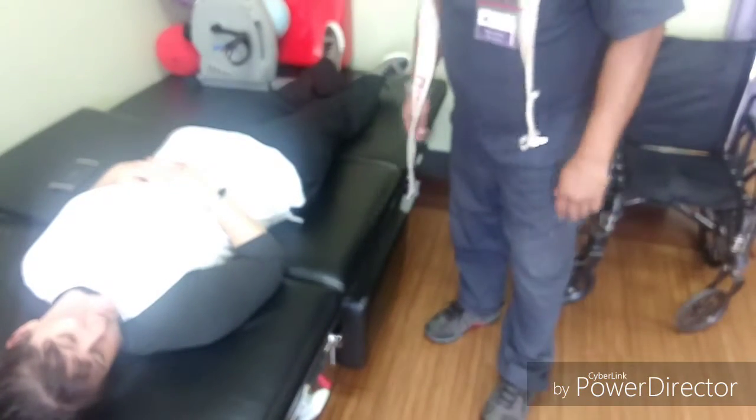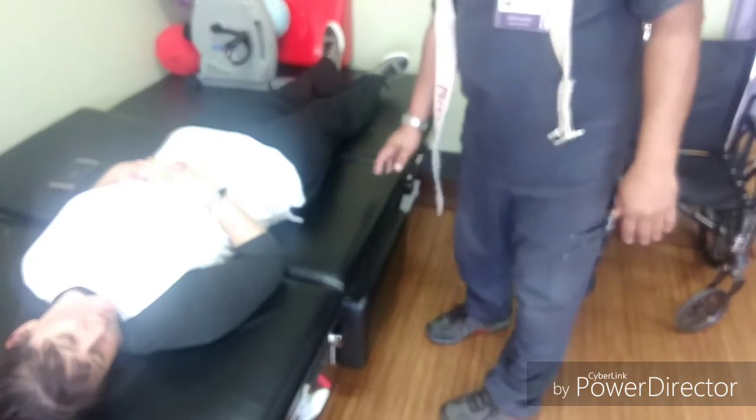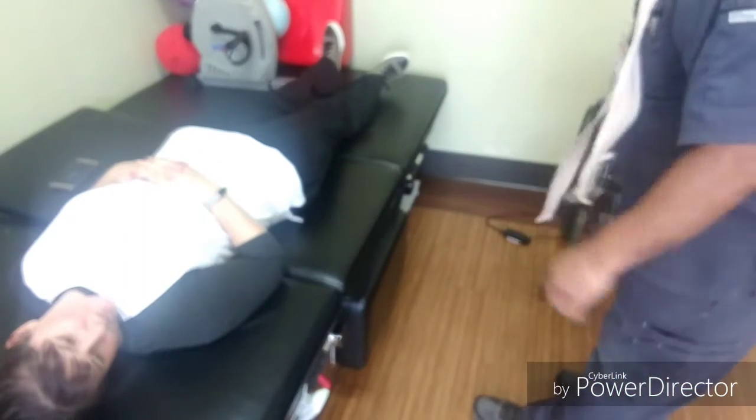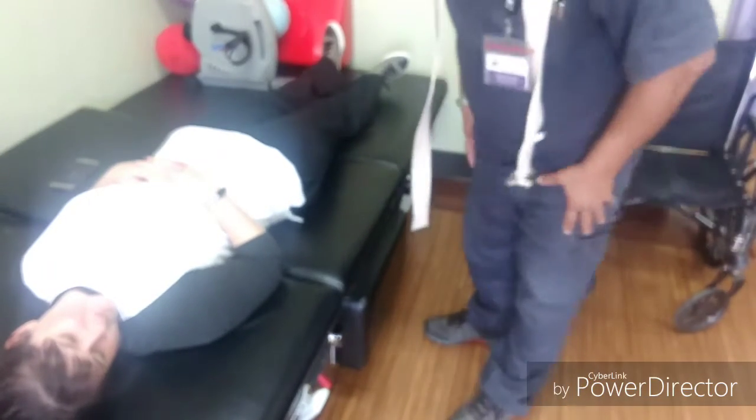Okay? Hi. Today you will be playing the role of Fred for this video so that we can show Fred's caregivers how to properly sit to do a stand pivot transfer from a sitting position to a wheelchair. Okay? Okay. Thank you very much. You're a great sport. All right, folks.